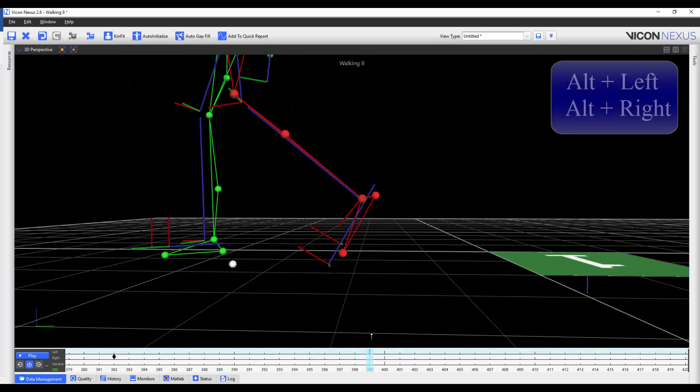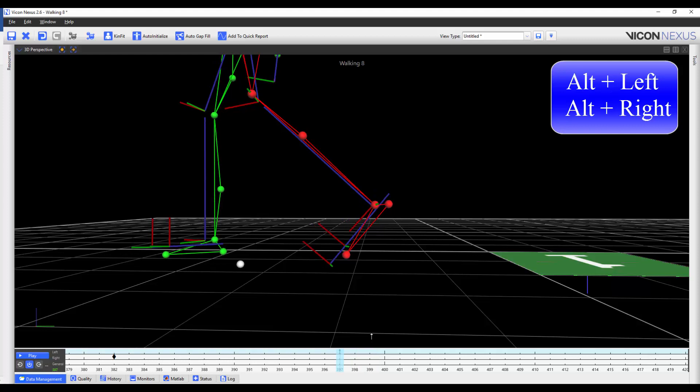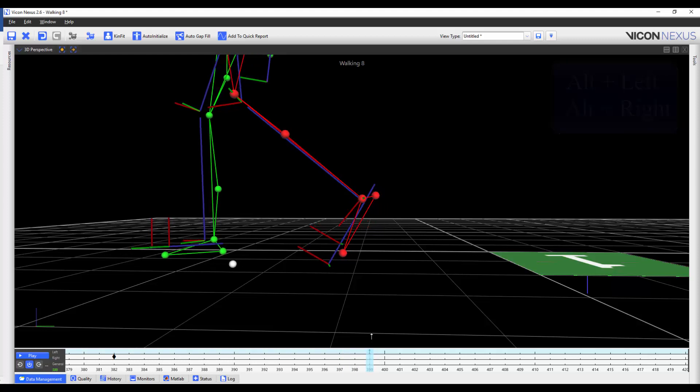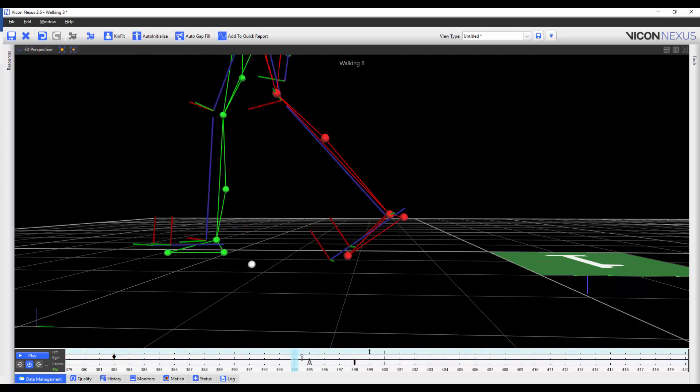When you are on an event, you can press Alt-Left or Alt-Right to shift the event either back a frame or forward a frame. You can also click and drag the events using the mouse.